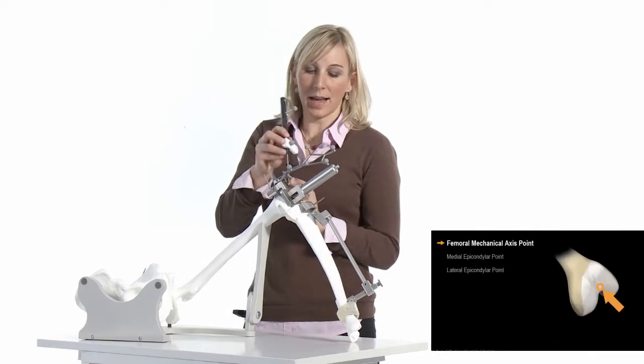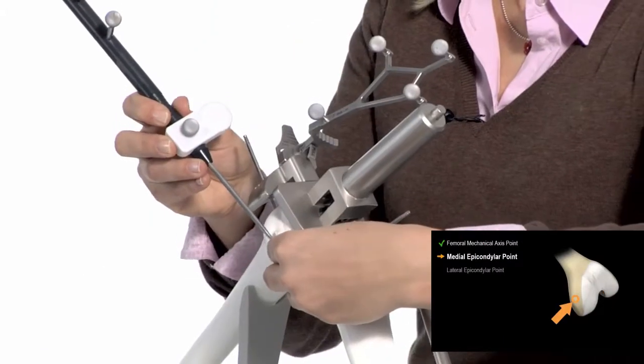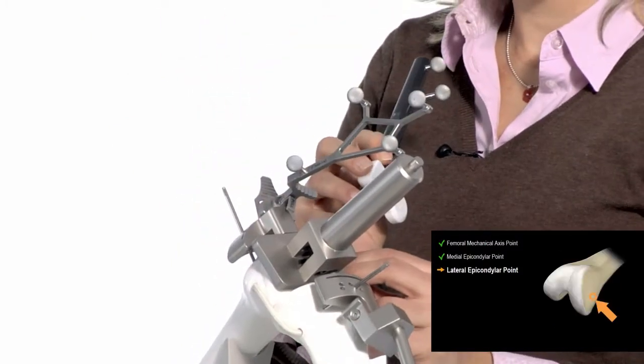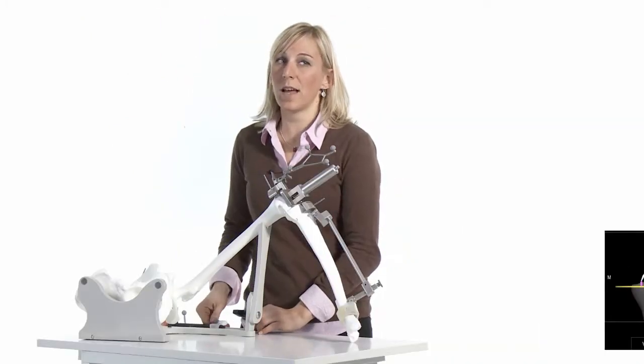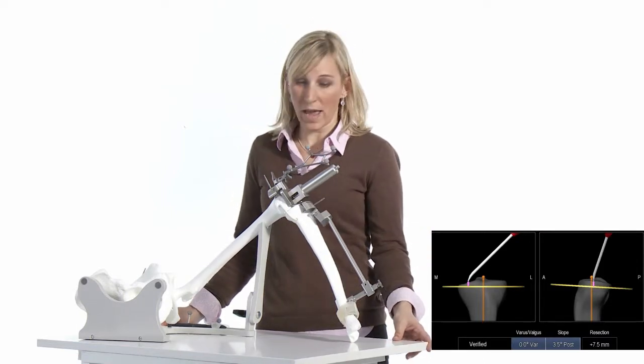Then you take the mechanical axis and finally the rotational references. The registration is done, and again the software shows you the values for varus/valgus, slope, and resection height.